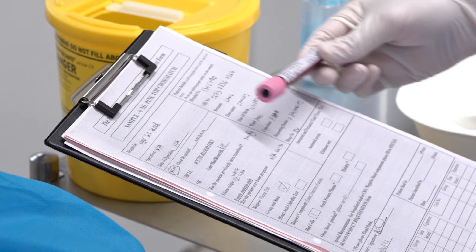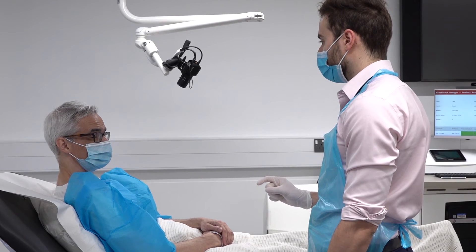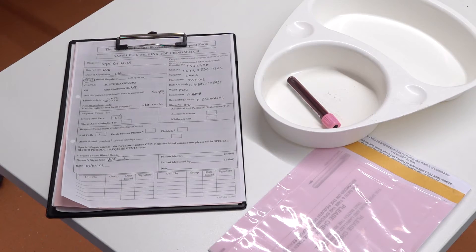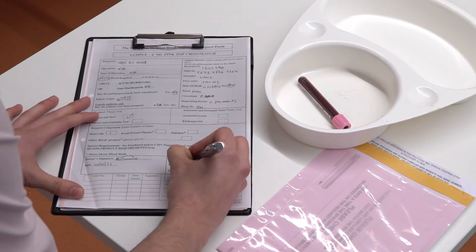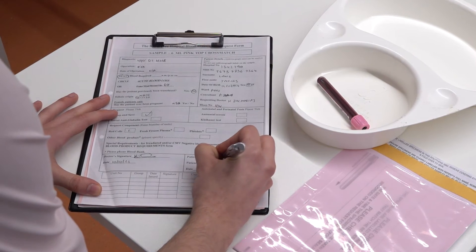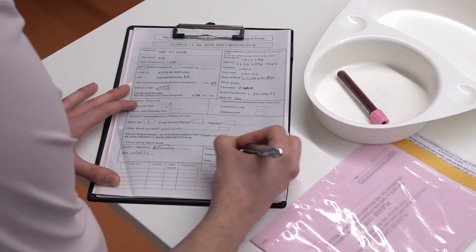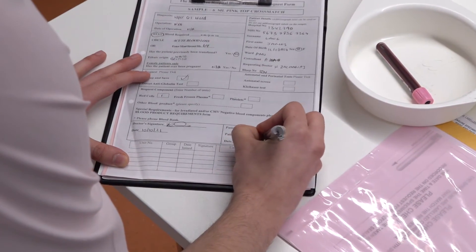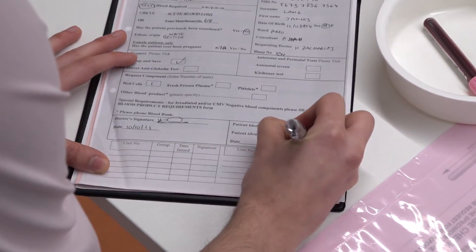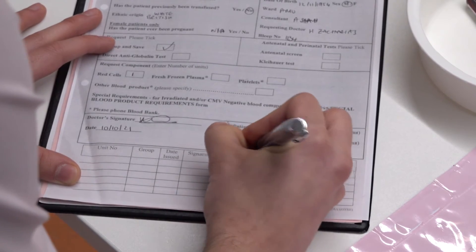Thank the patient and explain the next steps. Complete the transfusion request form, documenting the date and time the sample was taken, and sign the form. Some trusts require a second signature on both the form and the blood bottle to act as an extra safety measure. Place both the request form and the labelled bottle in the appropriate blood bag and send to the lab for processing.